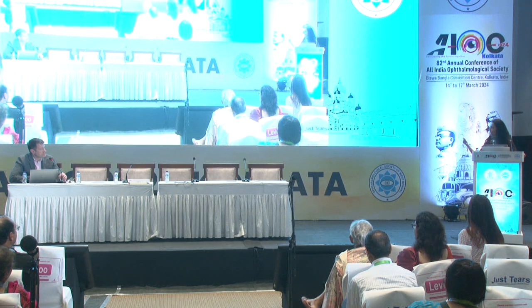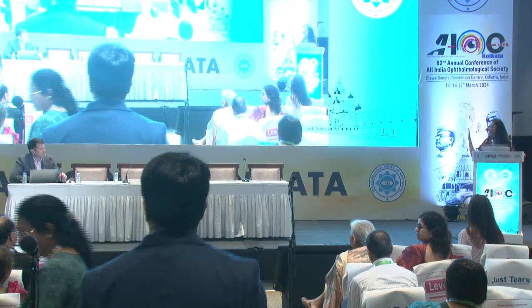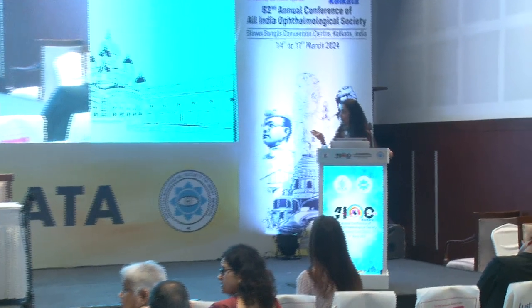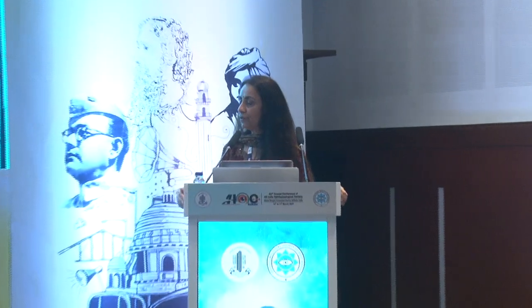Now, again, I see those ectasias in the grafts early on after their PKs. So typically when they're in their 60s or 70s and they're getting cataract surgery, if they haven't had that ectasia at that point, they're unlikely to have it. So in those patients, I'm very comfortable doing that. If I have a young patient who, for whatever reason, got a cataract and they need that, then I do not do a toric lens in those patients because I do expect them to change over time. But once they're past the age of about 40, I'm a little bit more comfortable, because I figure they would not get that thinning if they haven't had it at that point. If they have had some, then I'm a little more careful.